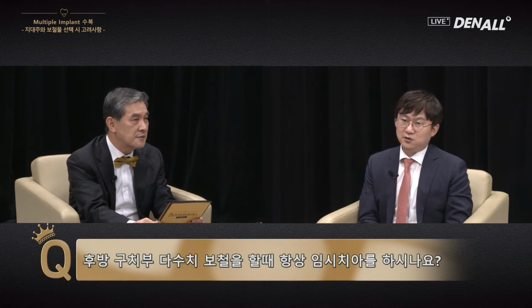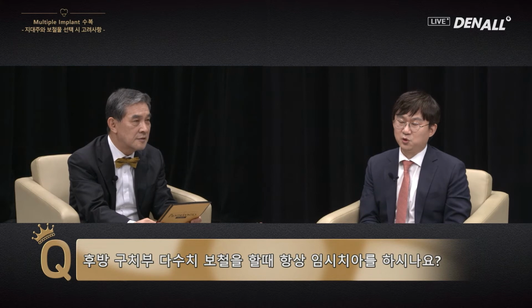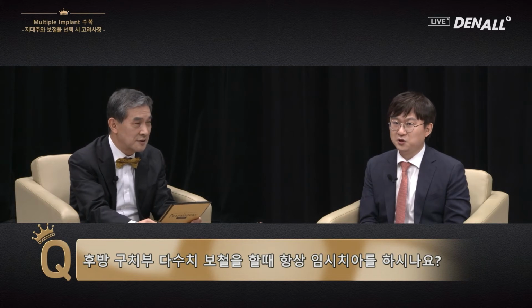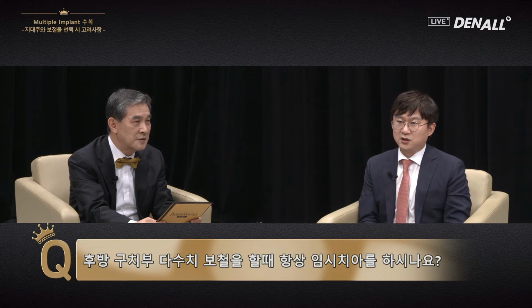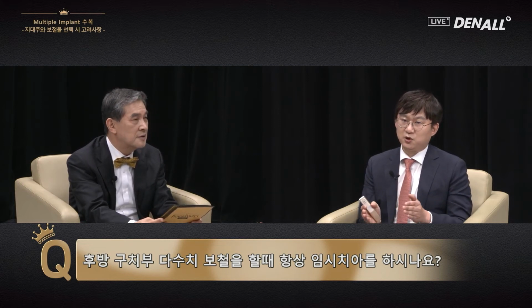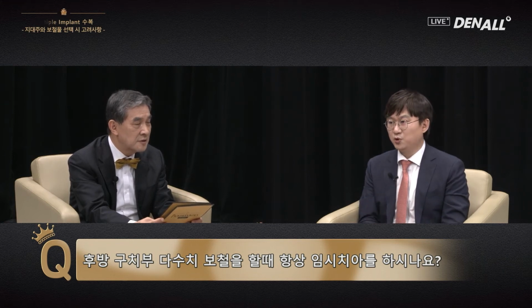My ideal cannot be exercised all the time. Sometimes I have to do insurance implant and a patient asks for very quick treatment. I cannot use the ideal approach all the time, but still I use a standard approach, and I find that some patients need to use a temporary. This is the criteria that I use.